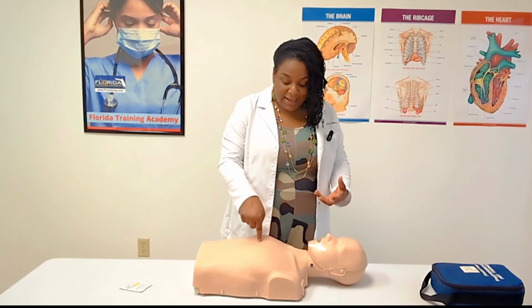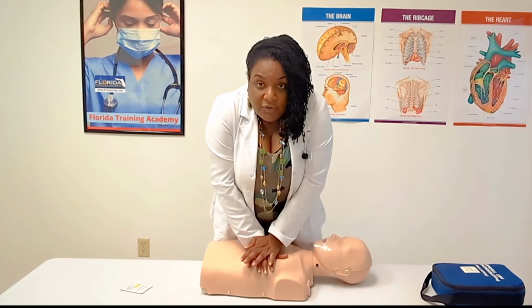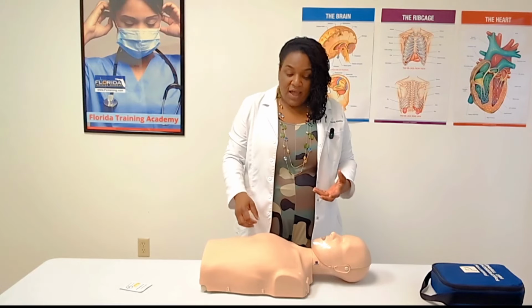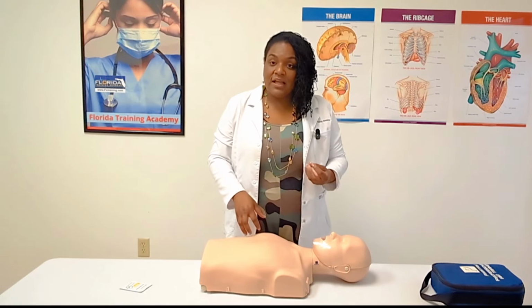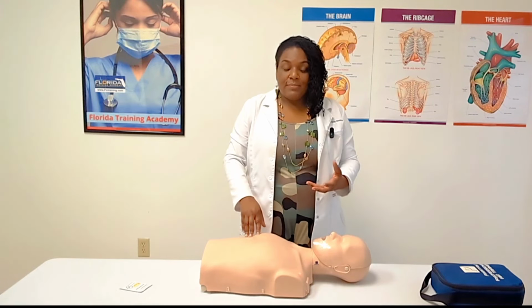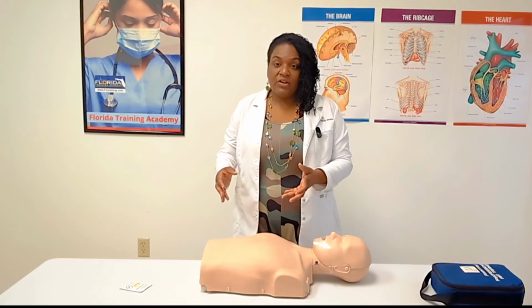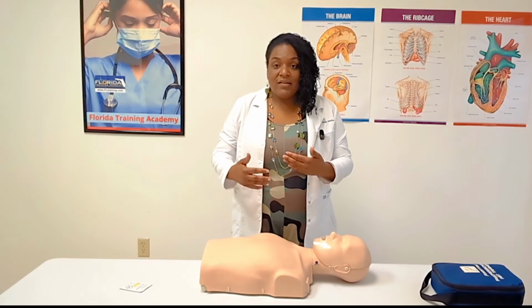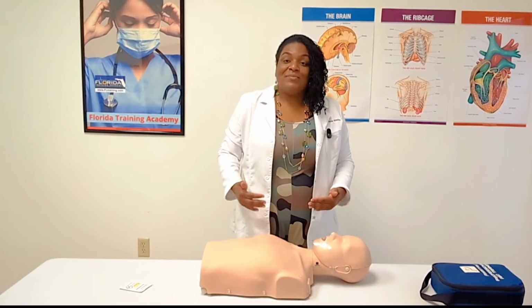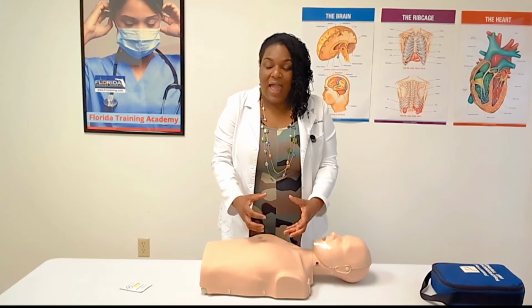So I'm going to put my hands in the center of the exposed chest. I'm going to lock my elbows and press down straight. Our mannequins have feedback devices, so when we press down at least 2 inches, it clicks. It also has lights or indicators in the shoulder, which help us keep pace with our rate. The goal is 100 up to 120 compressions per minute. With us being their external heartbeat for right now, we have to be faster than their heart because we're not going to be as effective.